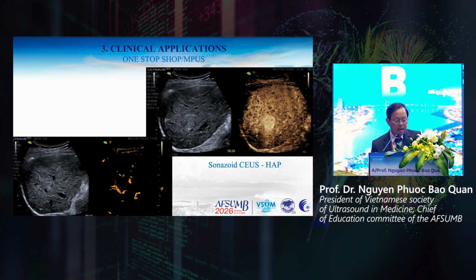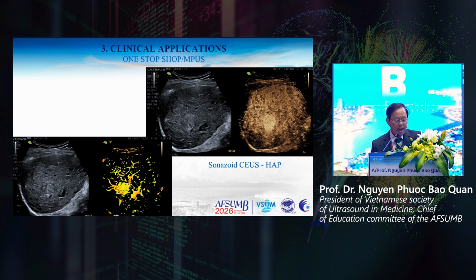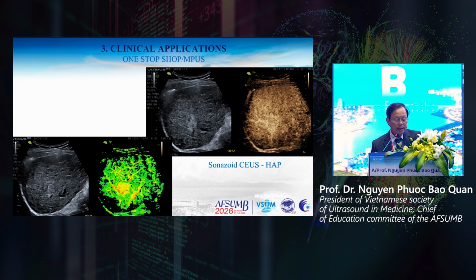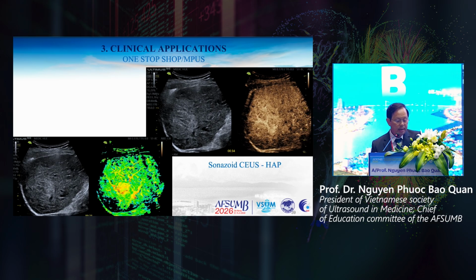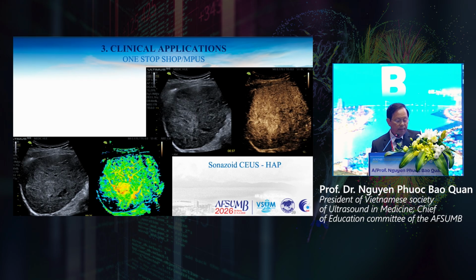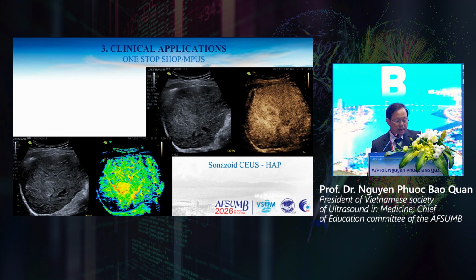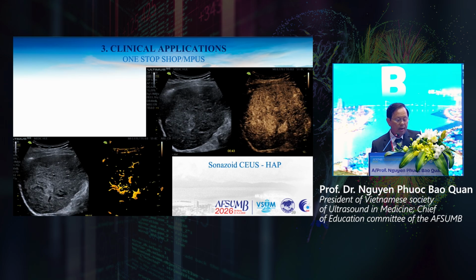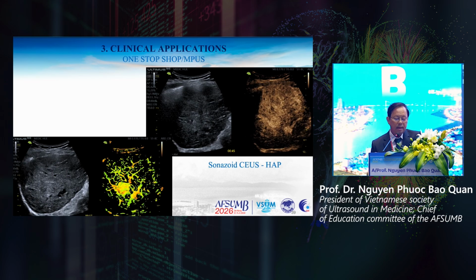After that, at the end of the portal venous phase, you can see the washout of the lesion, and in the delayed phase you can see continual washout.